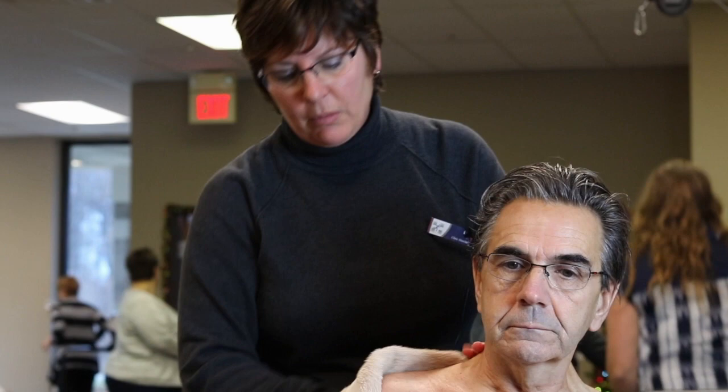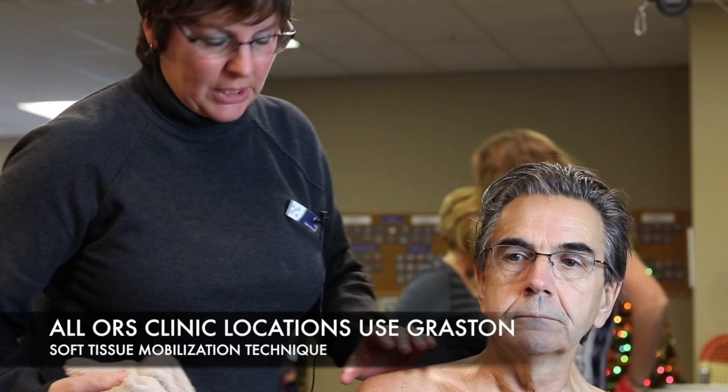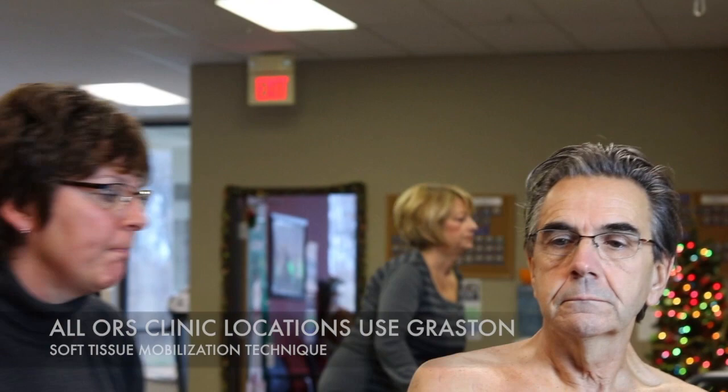For this type of treatment, we use it a lot for inflammatory problems such as tendinitis, bursitis, any kind of inflammation that might be a chronic issue where you have scar tissue built up around the area.